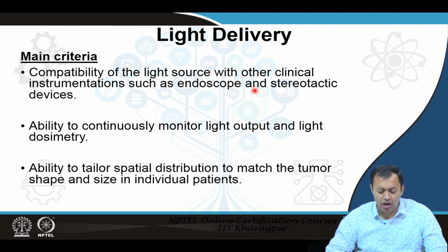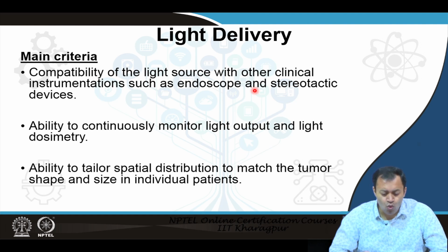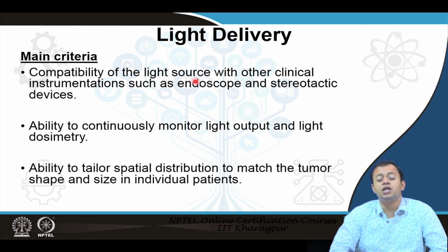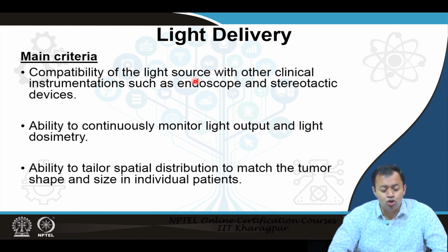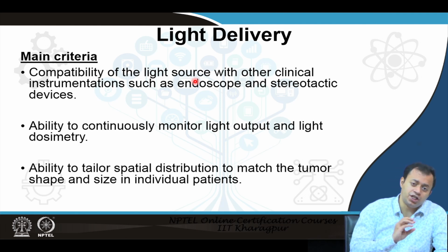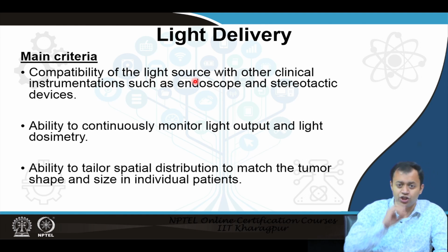So how do you deliver the light? Well, the compatibility of the light source with other clinical instruments such as endoscopes and stereotactic devices matters. So one of the main reasons why we utilized optical fiber is because we wanted to connect an endoscope with it so that we could monitor the environment in real time: the tumor getting destroyed, getting burned, getting oxidized.